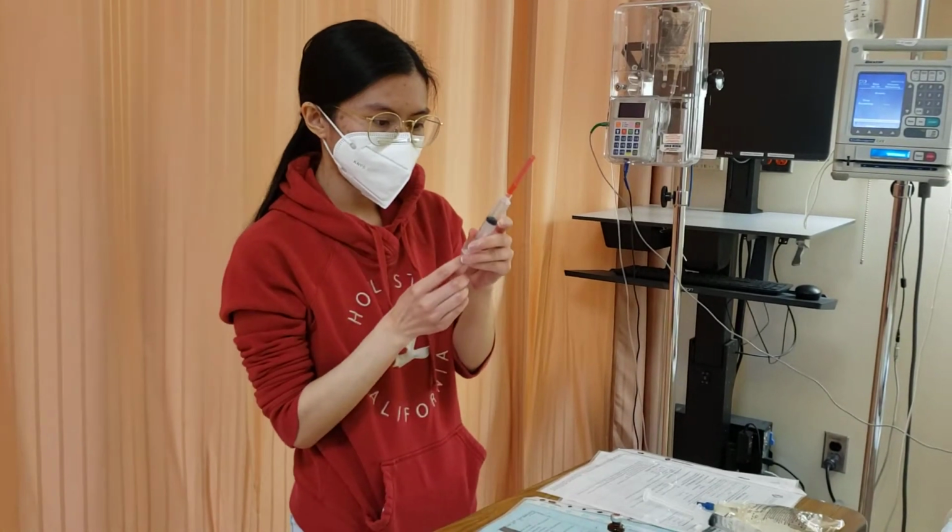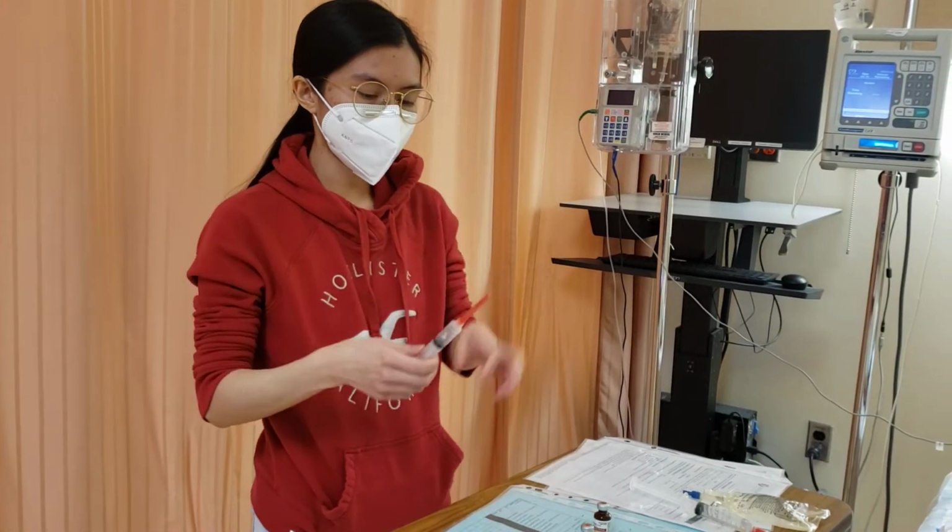Once again, I would need 5 ml from each vial to get that 10 cc of fentanyl.